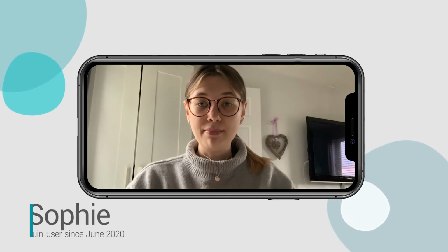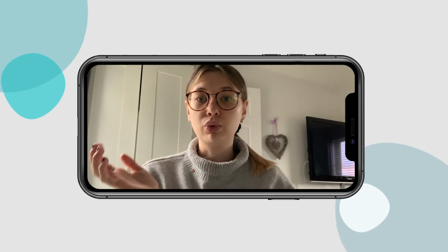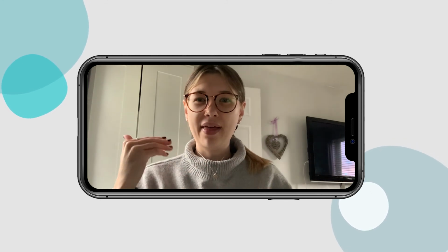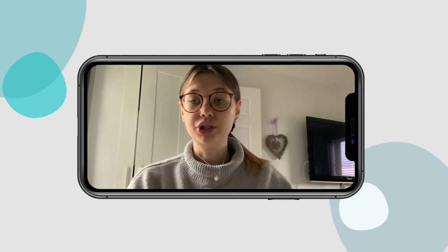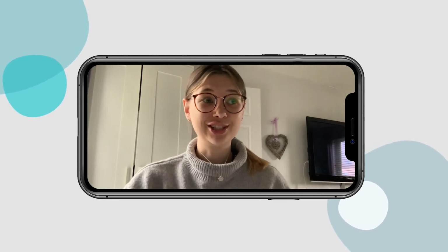So Quinn actually remembers your previous decisions. So now if I log my granary toast, it will tell me that last time you did this, you actually did a correction about an hour later, and it says you took 1.5 units. And then I can just bear that in mind. I can look at the What's Ahead graph and it will tell me what my blood sugar is likely to be based on what has happened to my blood sugars previously. And Quinn has honestly helped me to master the breakfast spike, which is just amazing.